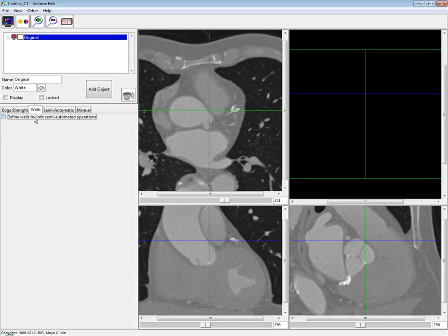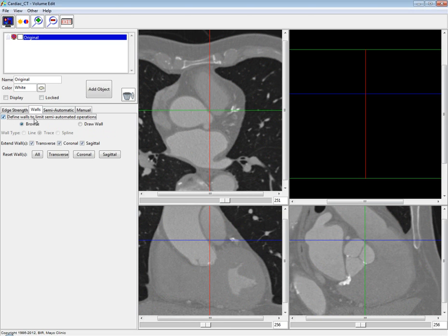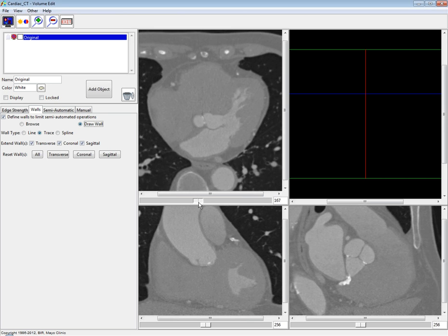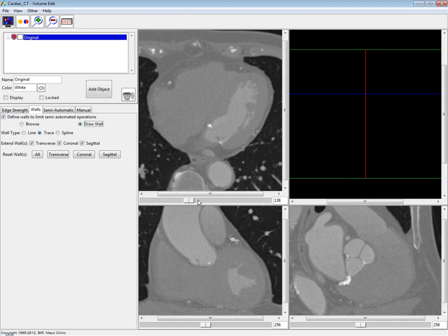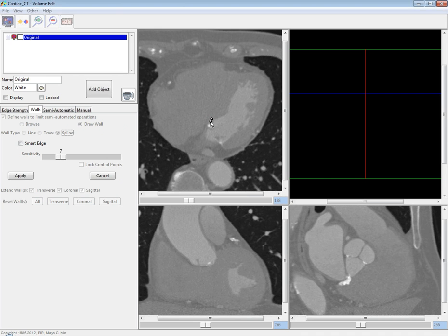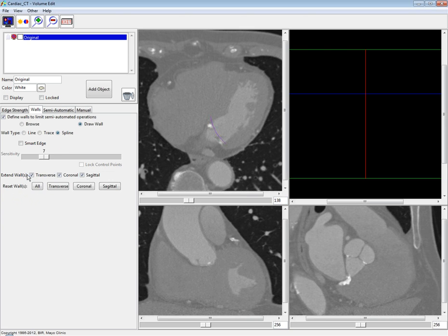I'll check to define walls to limit semi-automated operations. The new feature here is a spline wall type. If I choose draw wall, I'm going to define a wall between the left ventricle and the left atrium. If I choose this spline option, I can just click to set the spline control points. Once you double-click, you can go back and move those spline points by clicking them with your middle mouse button and dragging. Once satisfied with your spline, you click apply and it's now been set as a wall.